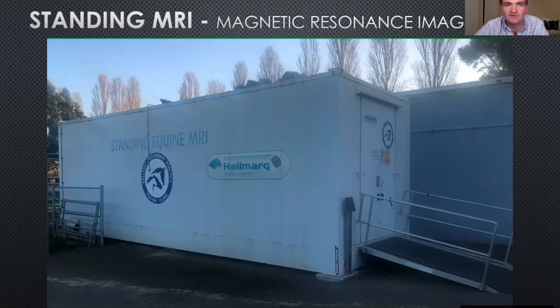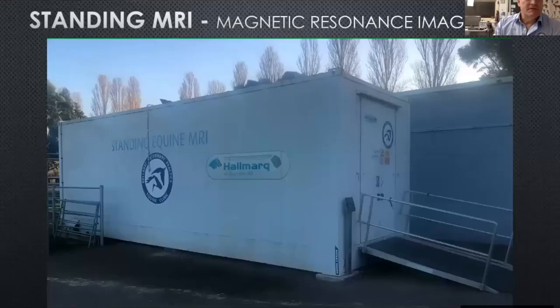So this is the standing MRI unit at Ballarat, and it looks like a shipping container, and that's because it is.